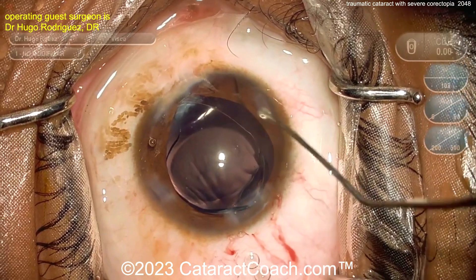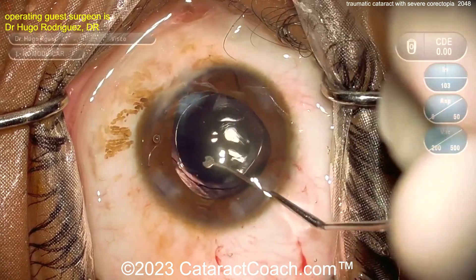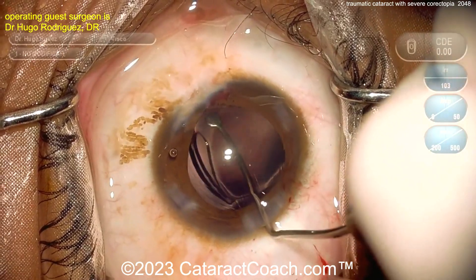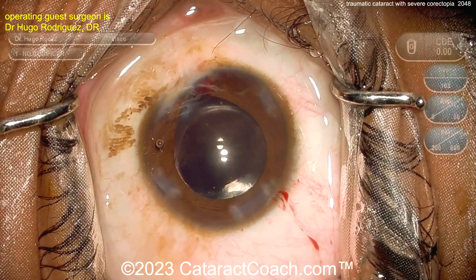Now here comes the lens — a single-piece acrylic lens going into the eye. Make sure it goes completely into the capsular bag. There it goes. Get that position dialed in. The haptics are being rotated 90 degrees away from the area of trauma, which should provide a good outcome.